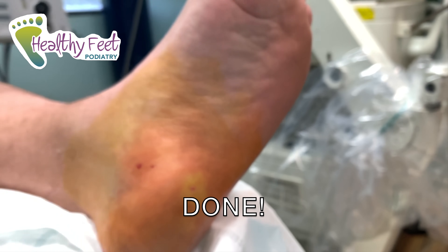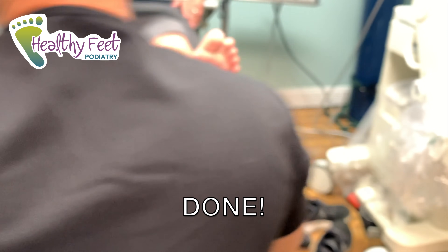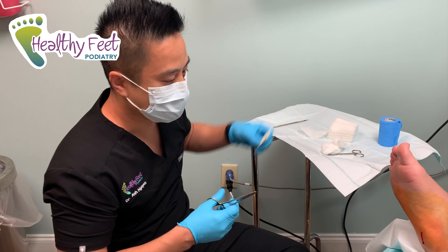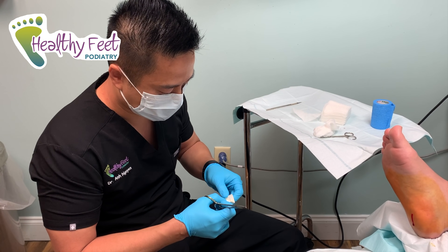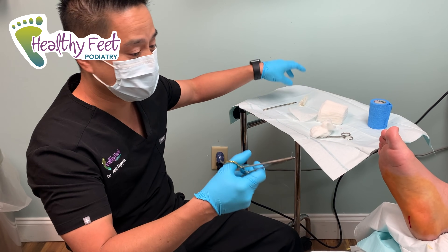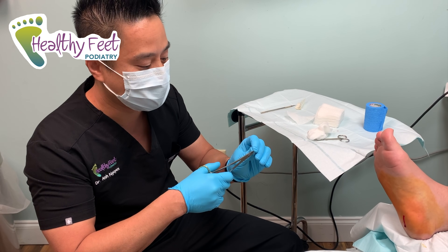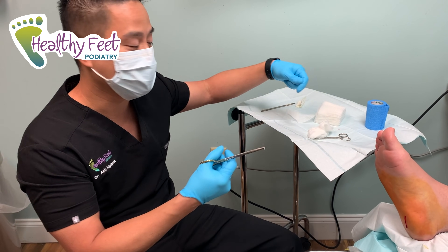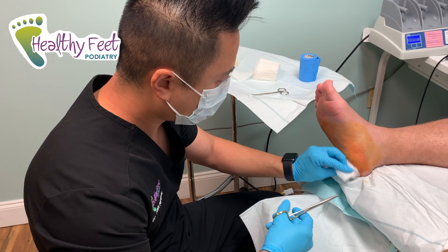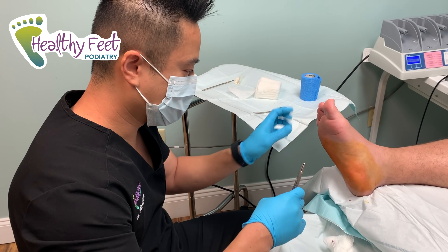Now we just stitch them up. I put one little stitch in — that stitch stays in for two weeks and then gets taken out. After that, he's going to be doing a lot of stretching, because we don't want the plantar fascia to reattach to itself and basically cause the same issue. Here's the little stitch in his heel.